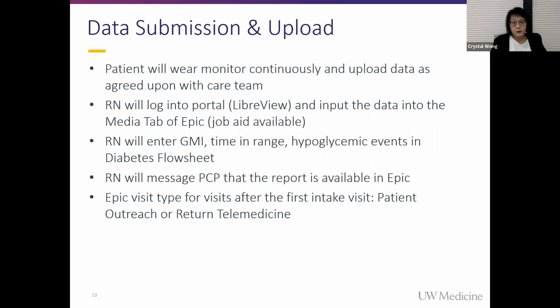We're going to talk a little bit more about the actual reports later, but this is where expectation setting up front with the patient and really good training is very important, because the patient really needs to wear their monitor continuously and remember to upload their data. Otherwise, you're not going to get enough data in the AGP report to do a good assessment and feel like you have enough data to change their medications, especially. So this is going to be taught by the RN and the RD.